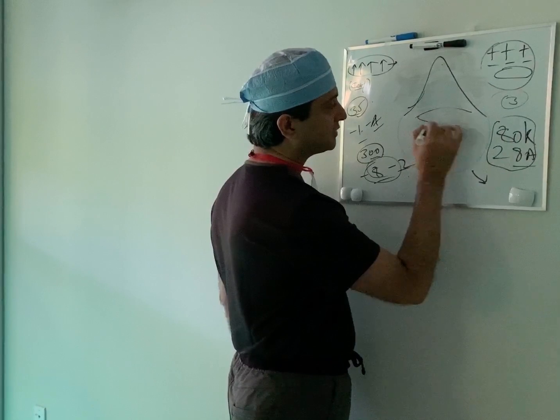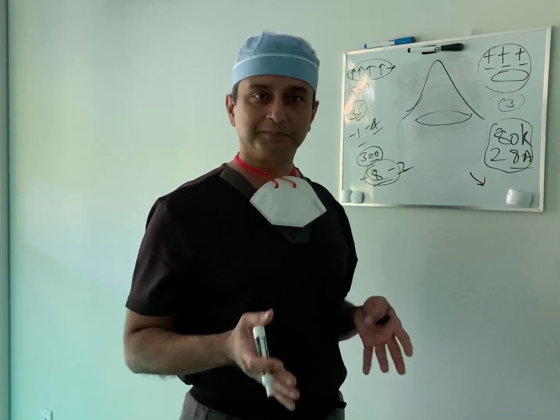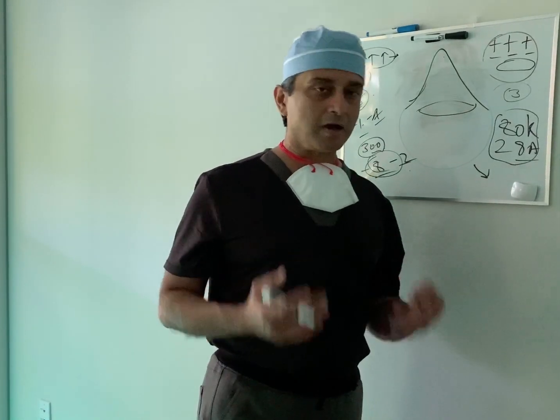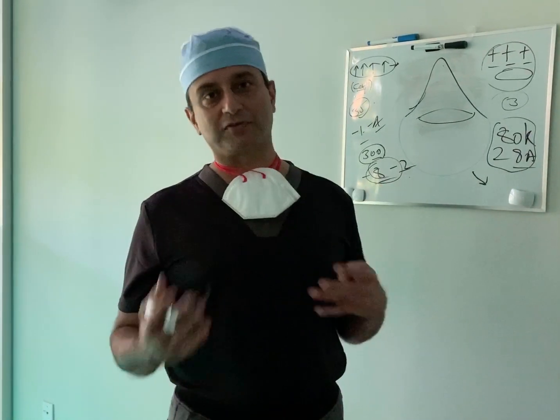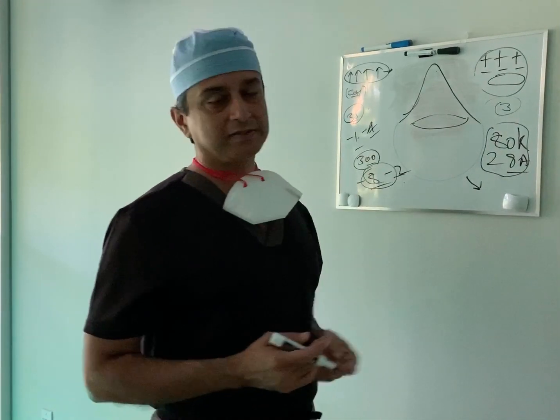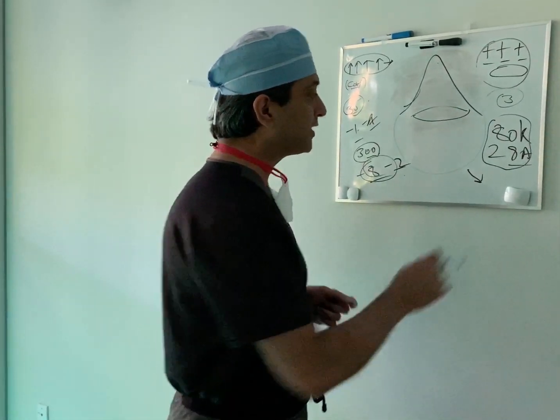Let's say this patient now has cataract. Attack the cataract like normal, go in with a toric lens, it works. Do not think something doesn't work just because you've not done it. And do not rely on these PowerPoint surgeons who predict and prophesy all the time. They have not done these surgeries. So I want you to understand these concepts and take your cone patients to 20/20 vision without glasses.